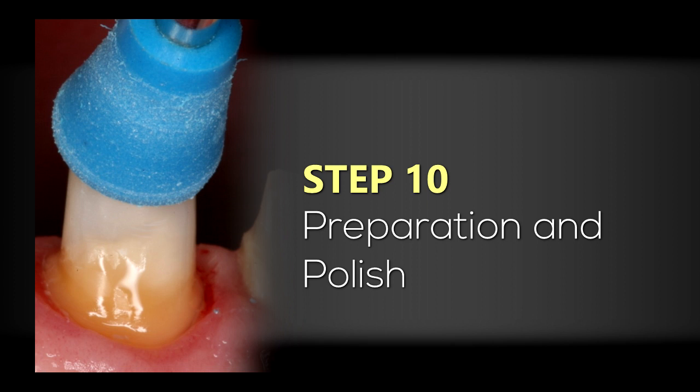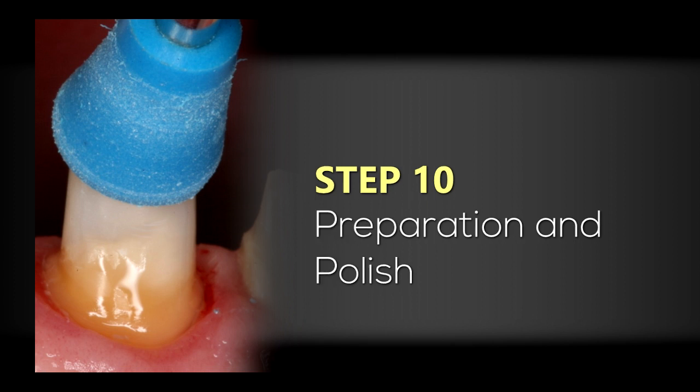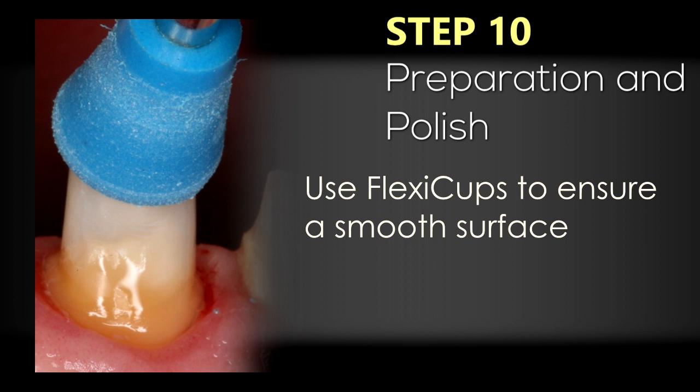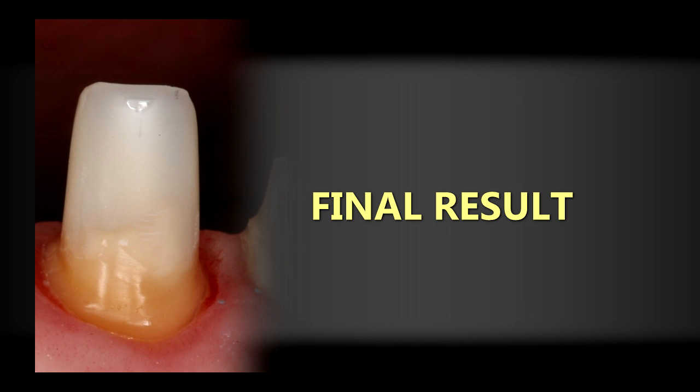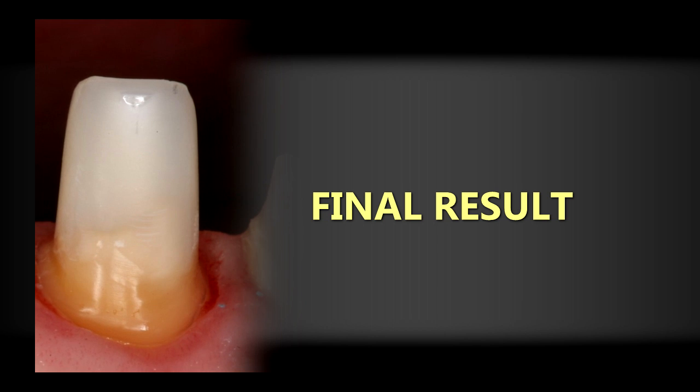Finally, I polish the preparation with rubber cups from Cosmodent — this is the Flexi Cup system. I want to make sure the tooth preparation is nice and smooth, which will make it easier and more predictable for my lab technician. I also want to make sure the Cosmocore is polished prior to making my provisional, because I want to be certain that my provisional doesn't bond to the core buildup material — since this is a composite material, very similar to the BIS-GMA materials used with provisionals. Here is the final preparation after completing the post and core buildup, preparation, and polishing with the Flexi Cup system.